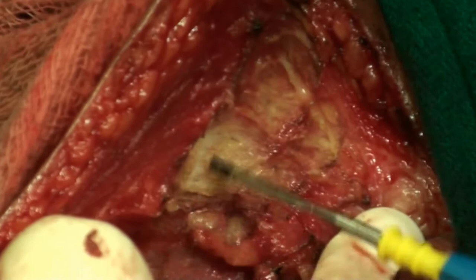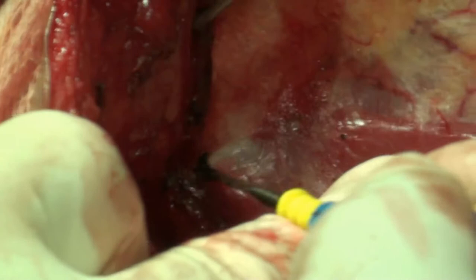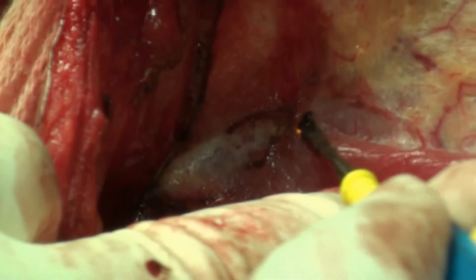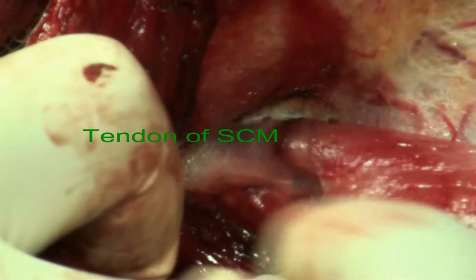Suddenly the light gets better. See now the two heads of the sternomastoid. We'll tell you about it later. I'm raising the flap to the extent that I can see the tendon. That's a very handy thing to do. That's the tendon of sternomastoid. Can you see that? Yes, sir.